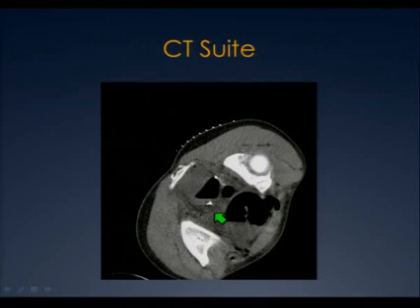Now, you'll notice right away a couple things. There is no IV contrast, so I can't see the blood vessels. The dose, the MAS, is very low. Now, at my place, the only thing I change is the MAS. I don't mess with KVP too often. Sometimes I do that for little, real small pediatric cases. I don't mess with the gantry spinning time, and I don't mess with the throughput time. I only adjust MAS because I don't want to overwhelm my technologists or my co-faculty members.